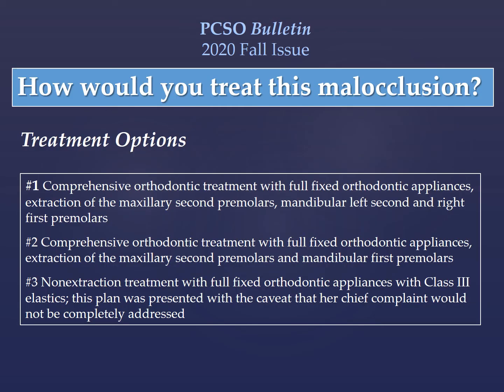The following treatment options were offered. The first option was comprehensive orthodontic treatment with full fixed orthodontic appliances, extraction of the maxillary second premolars, mandibular left second premolar, and right first premolar.